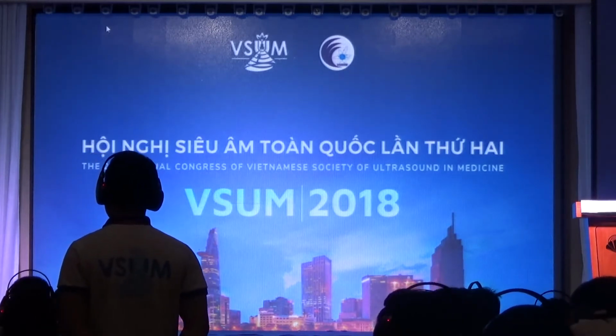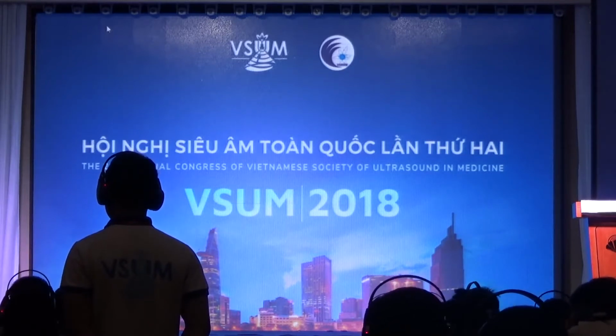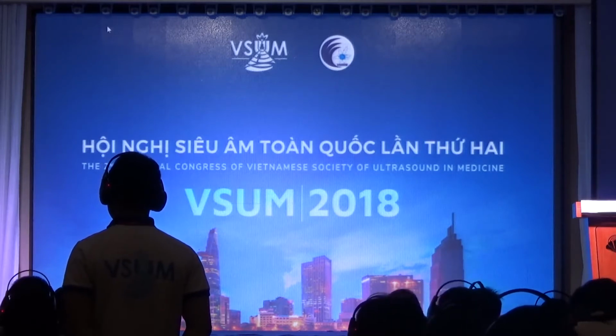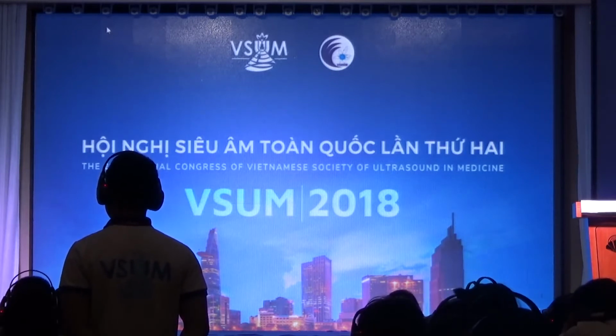Dr. Friedrich Rust did a meta-analysis with the Siemens system on several thousand patients. What we did is we took her data, and instead of doing cutoff values, we said, if you had a value of 1.5 meters per second, how many people were F1, how many were F2, how many were F3, how many were F4. So that's called the likelihood ratio.